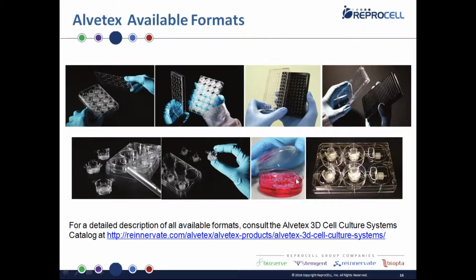And then the last one we have, which is an expansion of this really, is a perfusion plate. So here you can see it's a modified 6-well plate. You can have your little insert, and we have windows in between the wells. So we'll start at one end, and medium can be pumped into the first well and just through the whole system and out again. This can be very useful if you have even more medium requirement, because you can have an external medium bottle which is a higher volume with everything just circulating.